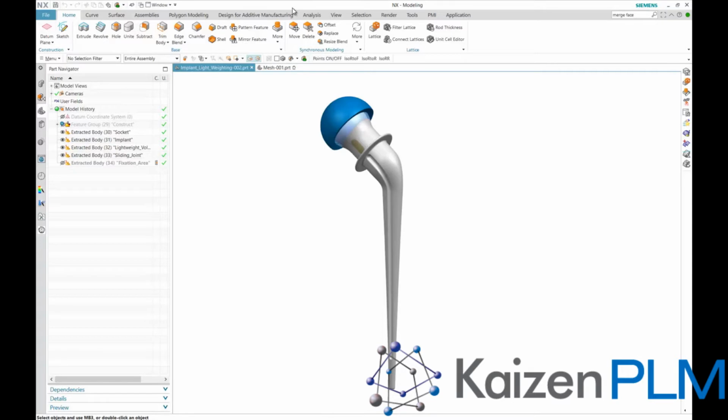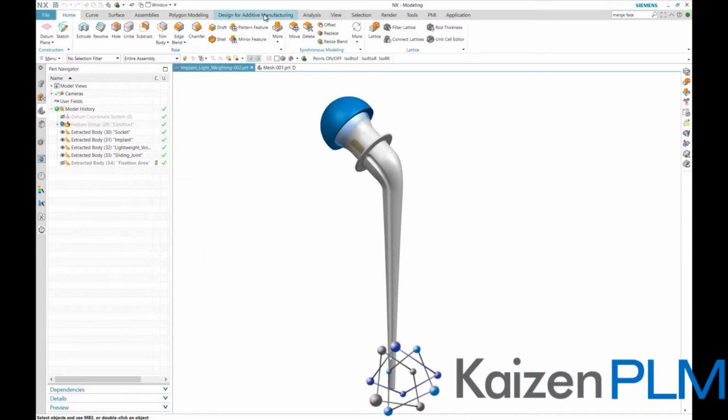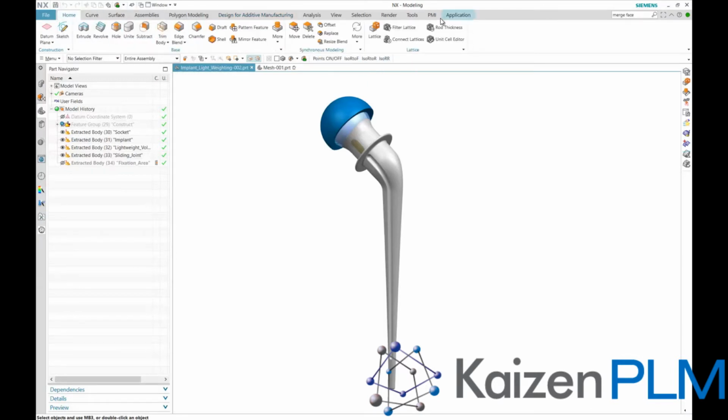To access lattice in NX, there are a few entry points. If in modeling environment and with the correct licensing, you can access it via Menu, Insert, Design Feature, and Lattice. Lattice is also accessible via the Design for Additive Manufacturing tab on the ribbon bar if activated. Here I have the Lattice group added to my Home tab for easy access.